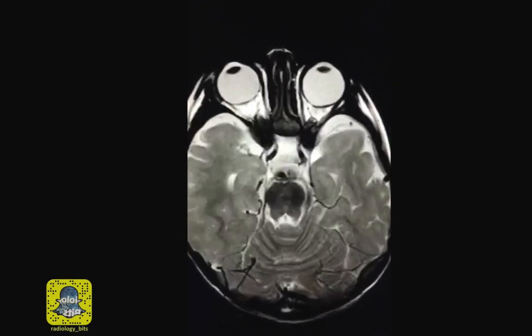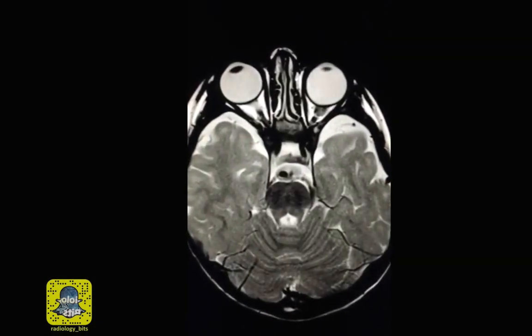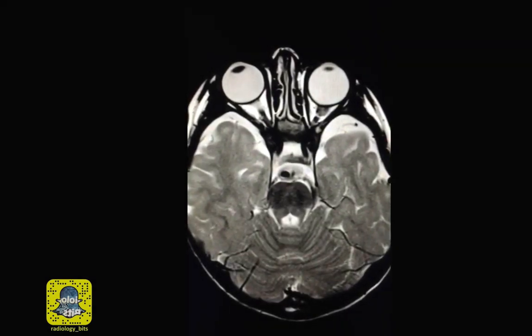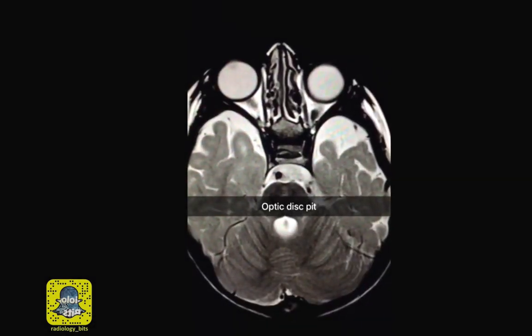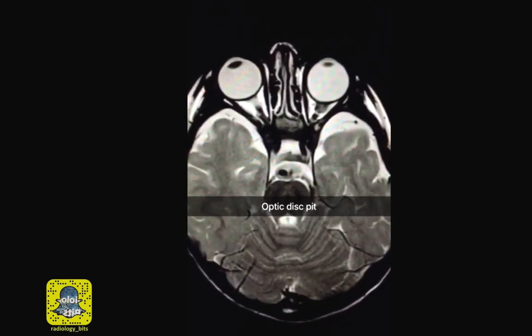This is a brain MRI on a 2-year-old female patient with a clinical requisition stating the following. Ophthalmologic examination revealing an optic disc pit.